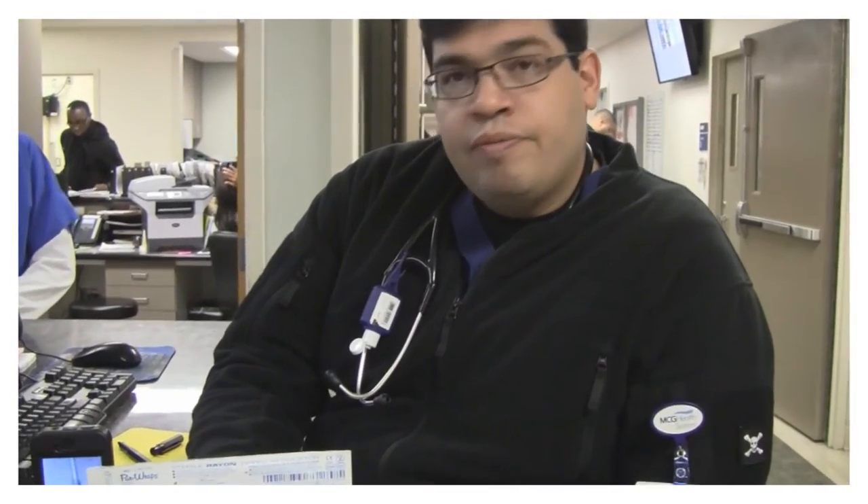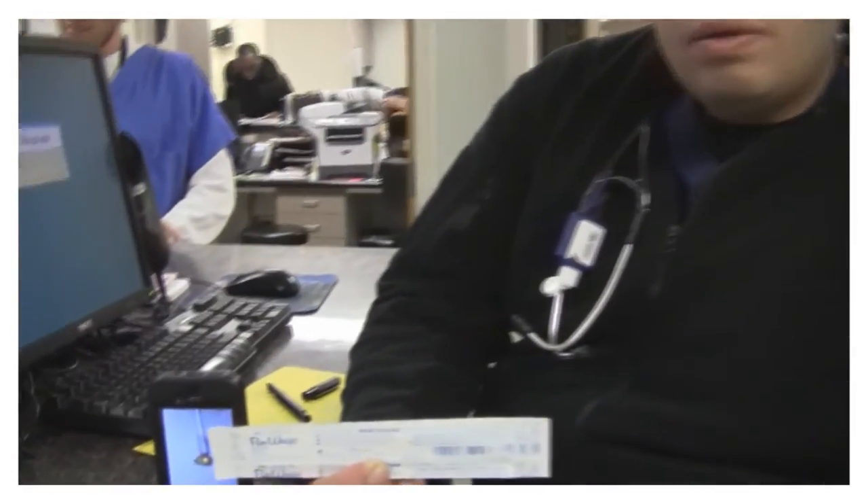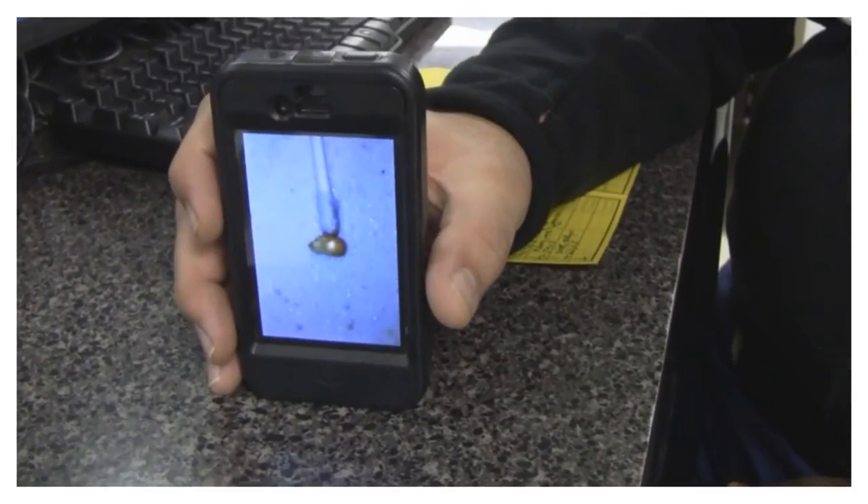Once I held it for a few minutes and felt that it might be adhered, I just pulled it out and out came the kernel. So in summary, the tricks here would be to use the rayon swab — we demonstrated that with actual cotton swabs it didn't stick very well. Then you let it gel on the tip of the rayon swab, put it in there, held it, and were successful.